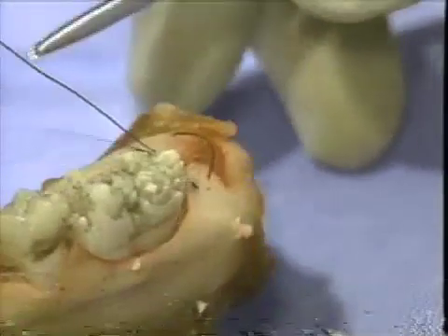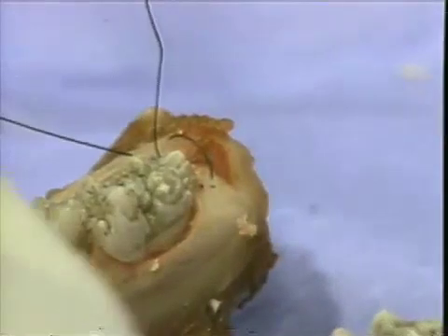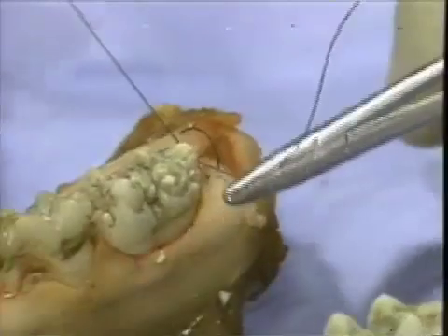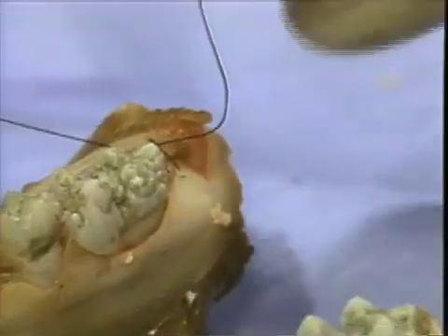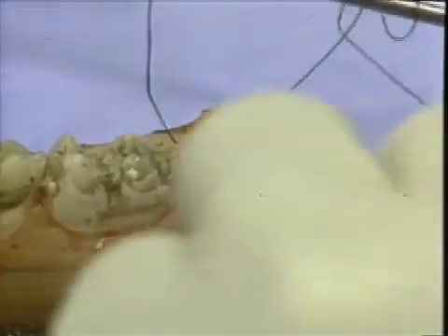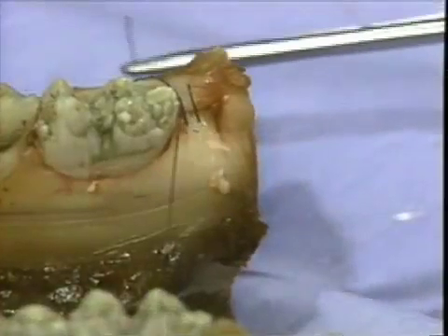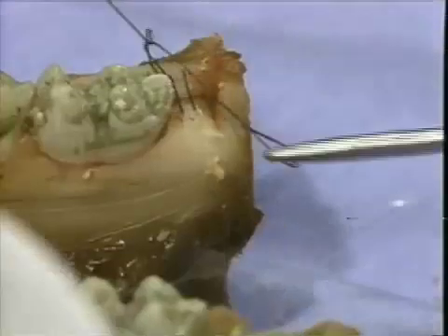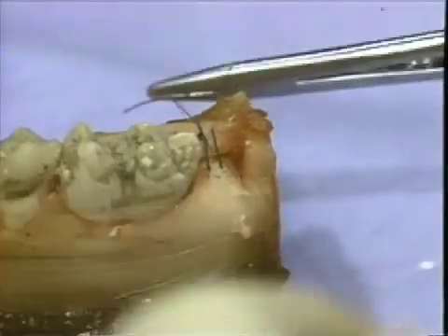The benefit of this suture is that pressure on closure tends to exert an apical displacing force on the gingival flaps, ensuring close contact of the gingival flaps with underlying bone, and an apical displacement of both the buccal and lingual flap in the retromolar area. A periodontal pack can be placed in this instance, or the suture itself can be used to determine the final position of the gingival tissues.